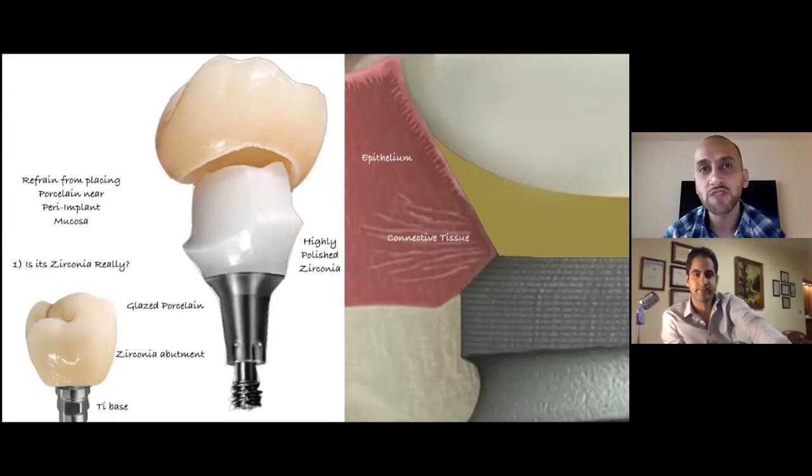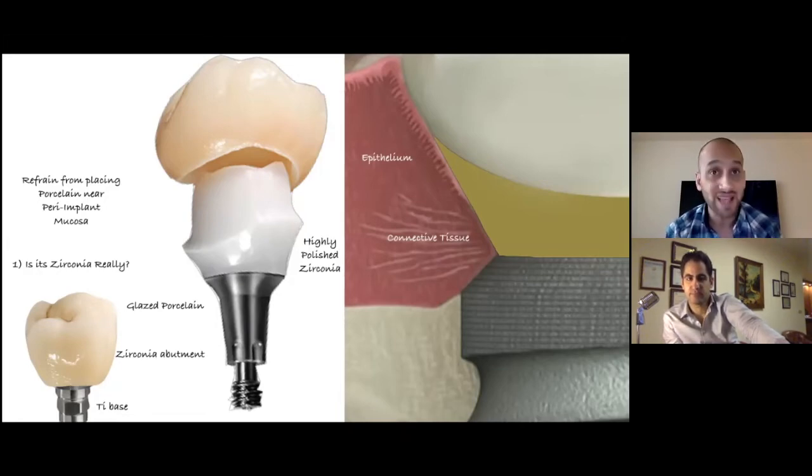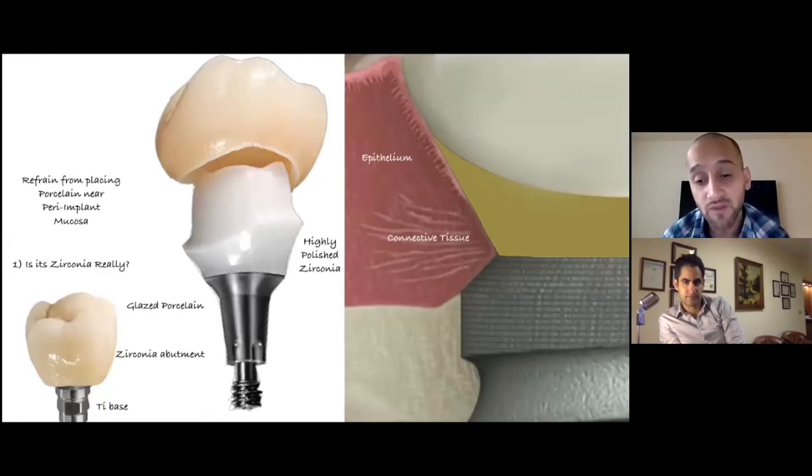But to be able to achieve what you want is very easy, right? Polishing zirconia by yourself or teaching someone to do it is very simple. You can buy these wheels, you can send someone to a small laboratory course where they can learn how to do that, or you can send one of your staff to one of your favorite laboratories for a day or two so they can teach them how to polish zirconia. It is not very difficult. And also, having a laboratory technician that understands these concepts will send you crowns that are already done.